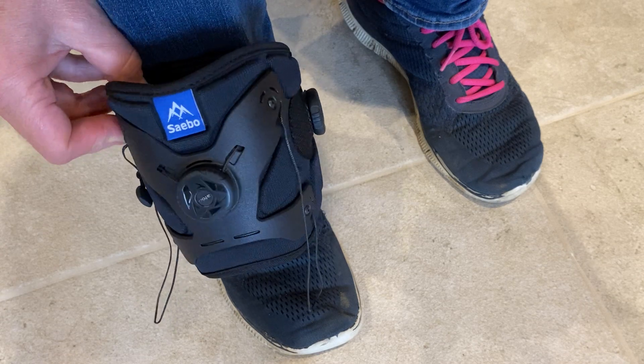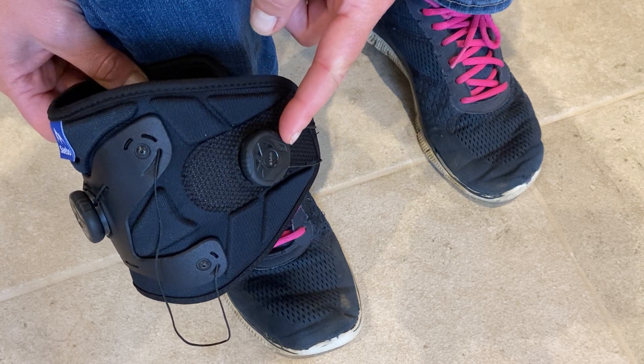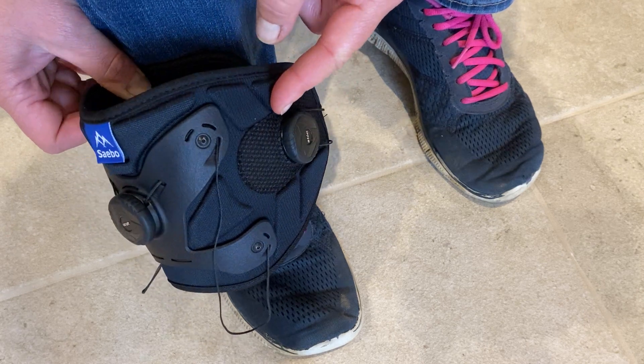I'm going to show you the features on our new improved SaeboStep. We now have a dial on the side to help with tightening up the ankle cuff with just one hand.